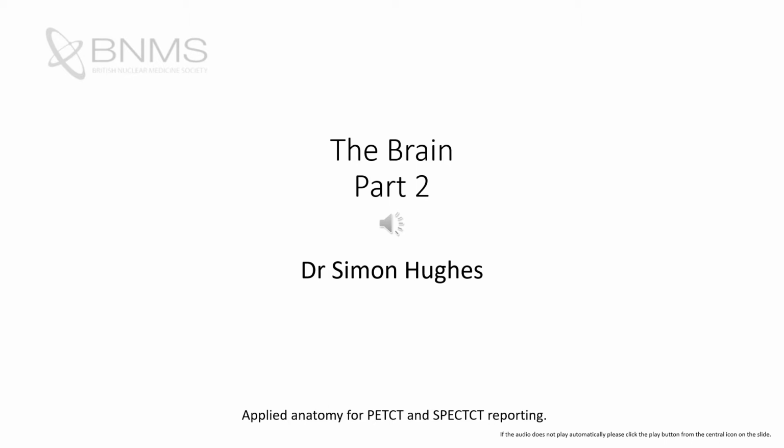This is part of the applied CT anatomy course for PETCT and SPECTCT reporting.